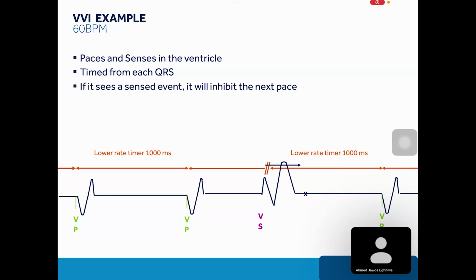Yes, clear. But when anyone asks me what T means in a dual chamber pacemaker in DDD mode, it triggers pacing after sensing the atrial activity.